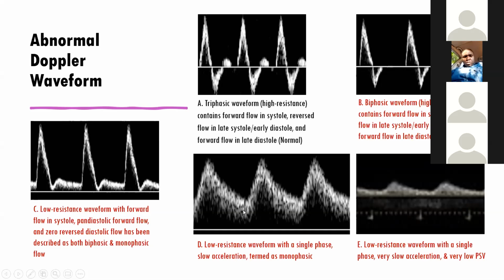You see this is only systole, so monophasic flow, and this is called tardus parvus flow. Tardus parvus means you see very slow flow, that's why very slow rise and again slow down, so that you will get very low peak, and then it is a little bit rounded peak, because it takes time to just get up and get down. Okay, this is tardus parvus flow.